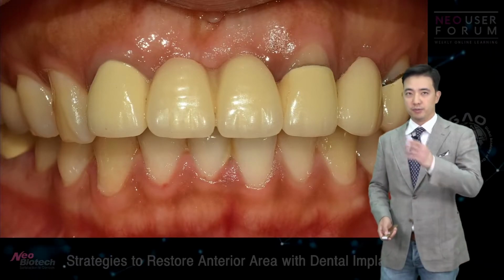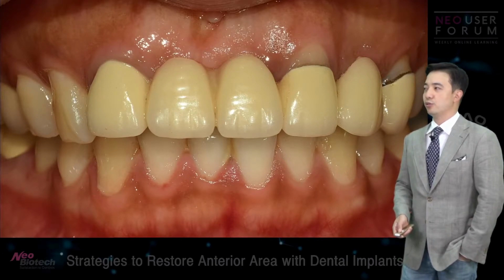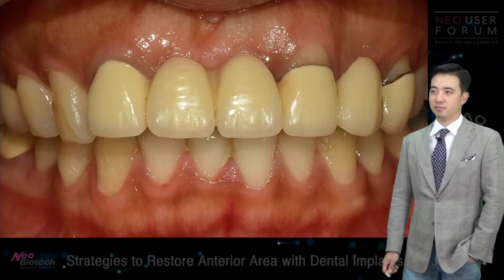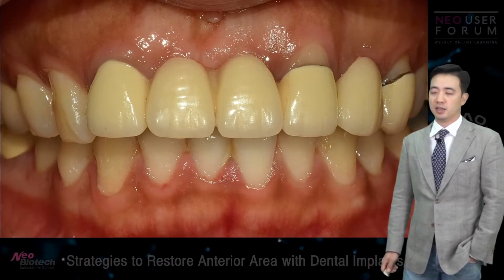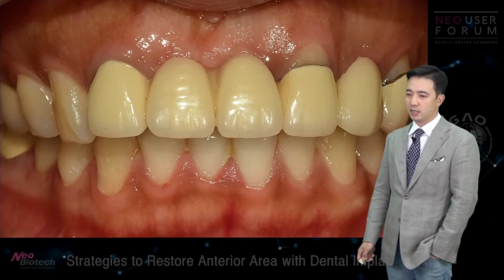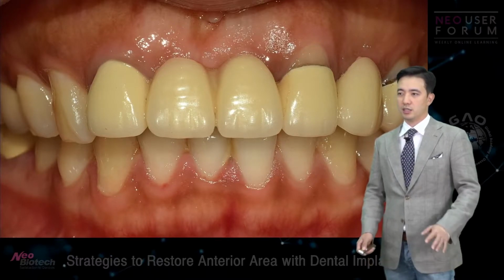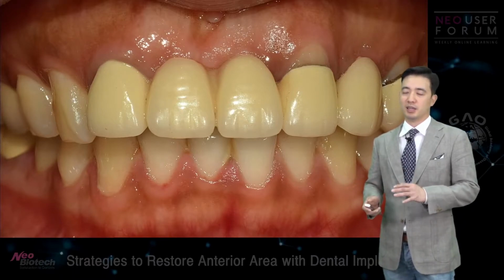So this is my first case. I just brought this case to show you some of my mistakes. I'll be honest with you, I'm not perfect at all. I do make mistakes. I learn from my mistakes, and this is one of the cases where I learned a lot. So I just wanted to share my experience of lack of strategy, lack of thinking ahead, something like that.